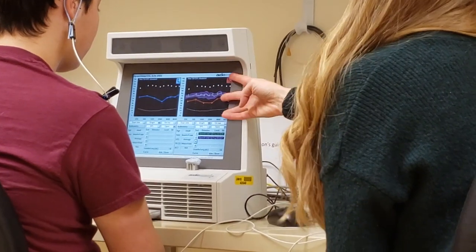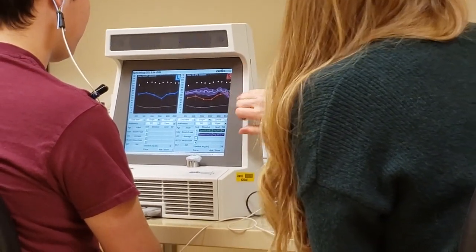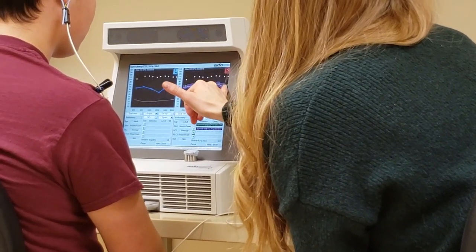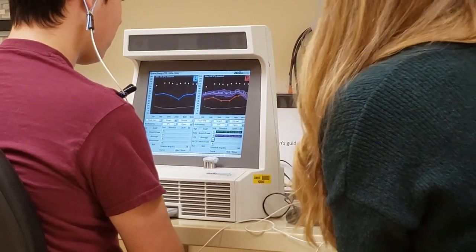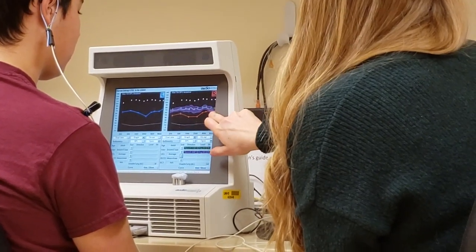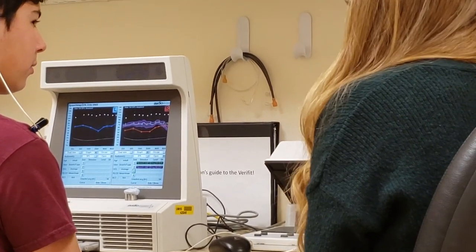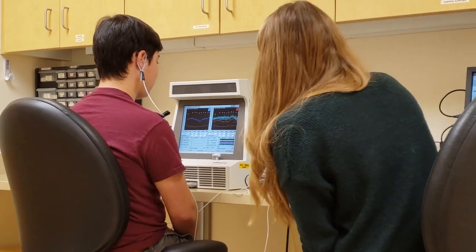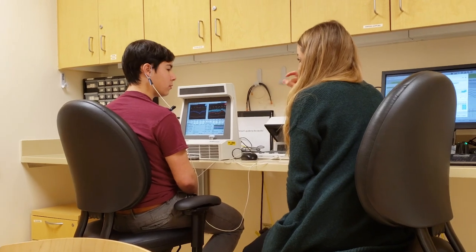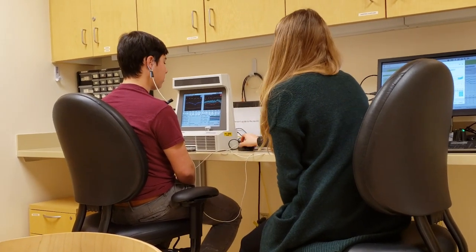So this is like your hearing test turned upside down. Soft sounds are at the bottom, loud sounds are at the top. We want this line to go through all of those crosses. So essentially everything is there except for this one at the very highest pitch that we test. I want to give you a little bit more volume because that can help distinguish with your S and SH sounds sometimes. It also helps with background noise. I'm happy with that one — it came up a little bit. I think part of the measurement in your right ear had a little dip at that pitch too, so sometimes that can be a little bit of a red herring.